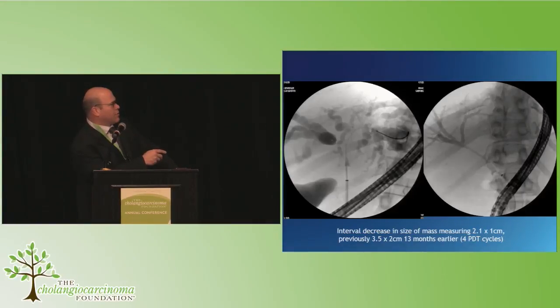It's X-ray material, that X-ray contrast that we see in the bile ducts, and then coming down. In this image, you don't really see many bile ducts here. You see these big bile ducts on the outside because there's a tumor here that's obstructing all the bile ducts and causing all of these to be very dilated.